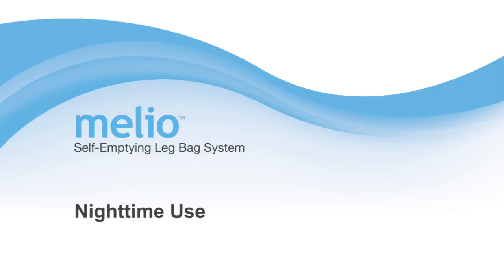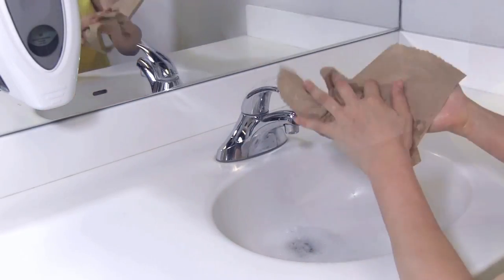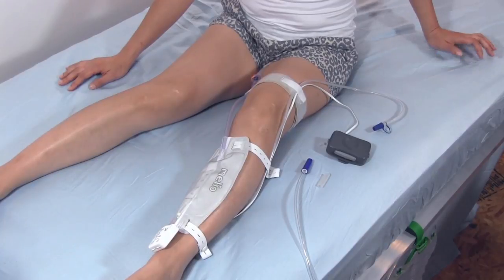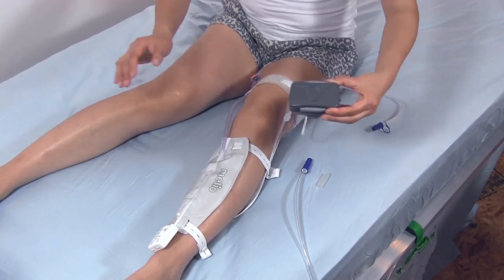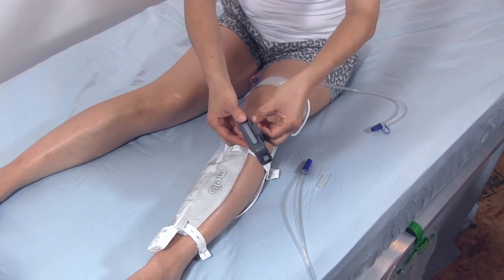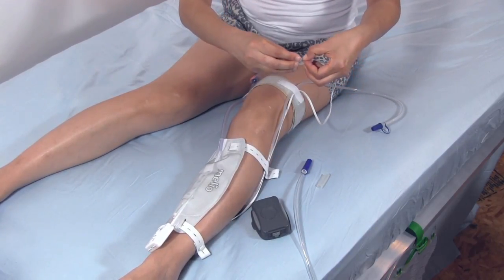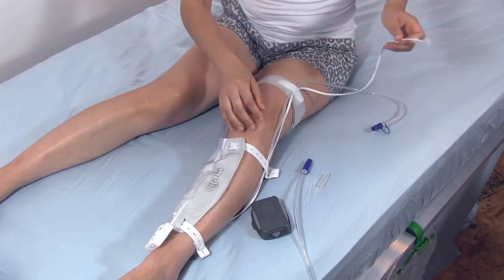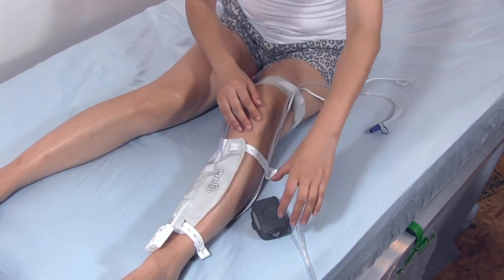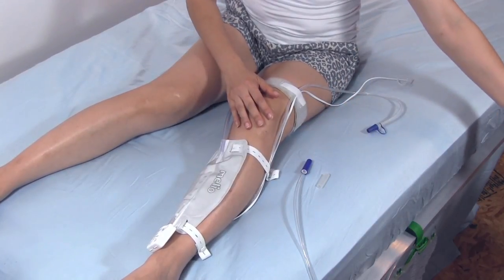Nighttime use. Please wash your hands and empty your leg bag. Turn off the controller and disconnect the controller cable. Cap the controller connector cover over the controller cable connector. You should store the controller in a safe location and recharge it if needed.